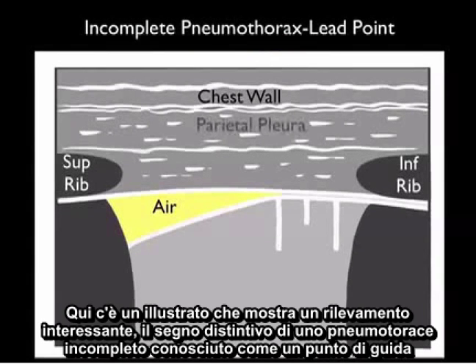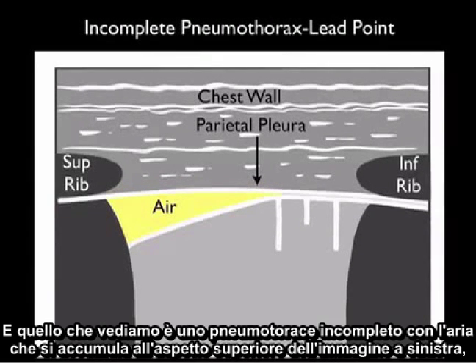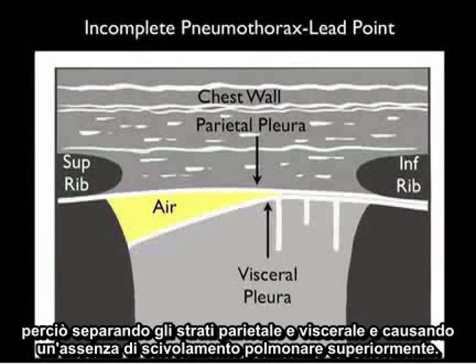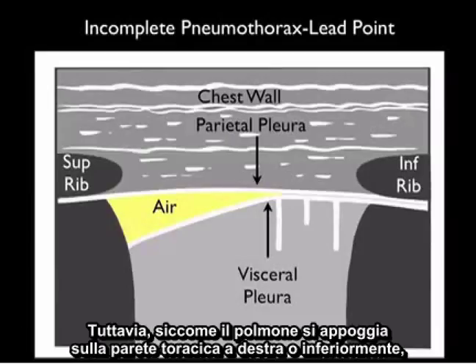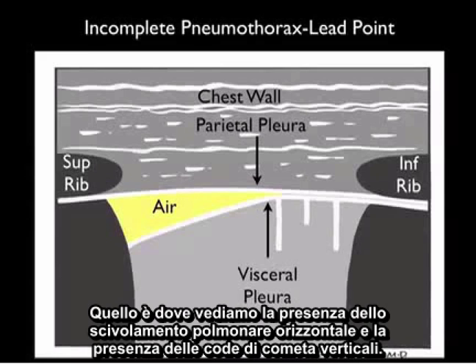Here's a pictorial showing an interesting finding — the signature of an incomplete pneumothorax known as the lead point. We see an incomplete pneumothorax with air collecting to the superior aspect of the image, splitting the parietal from the visceral layers and causing an absence of lung sliding superiorly. However, as the lung comes up against the chest wall inferiorly, that's where we'll see the presence of horizontal lung sliding and the vertical comet tails.